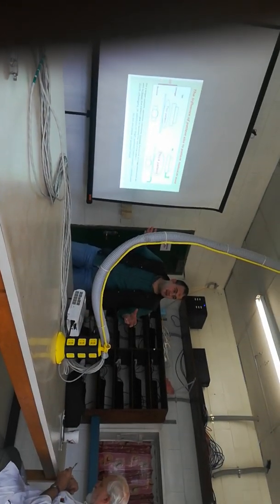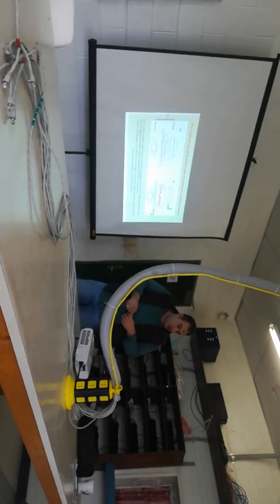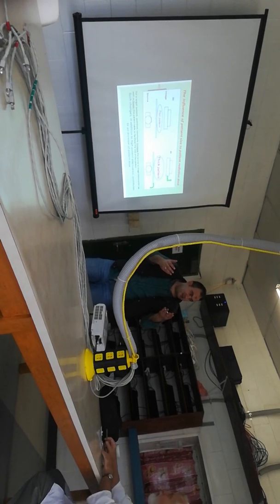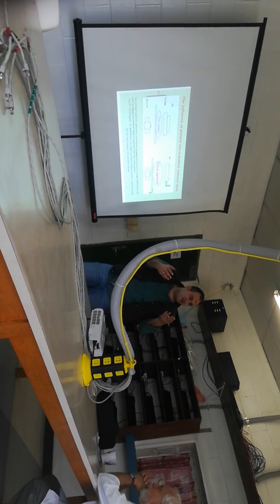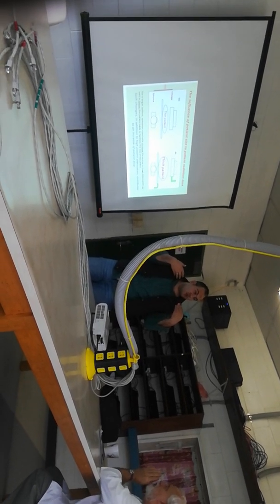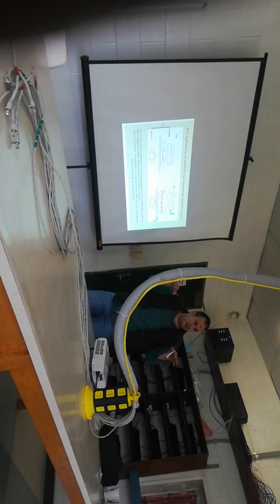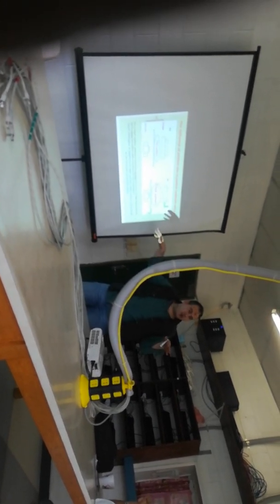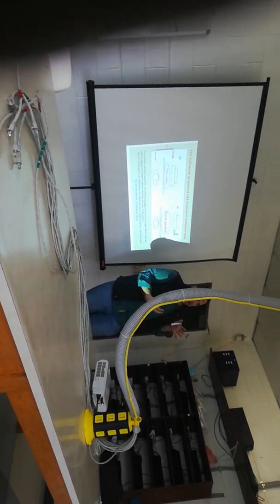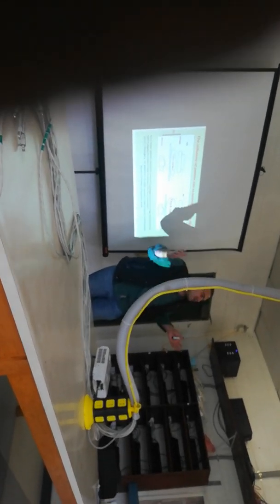For a thick patient, you have to reduce the X-ray tube to patient distance to get good image quality. But you have to know that now you increase the patient dose and you increase the scattered radiation to the worker. So you have to make an optimization. That's very important, because only for a fat patient do you need to get close, but not for all patients. For a thin patient, it's okay.